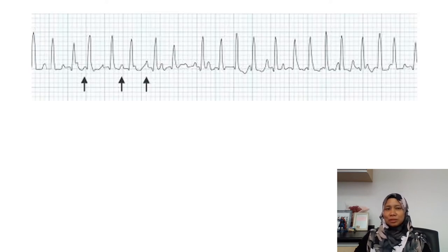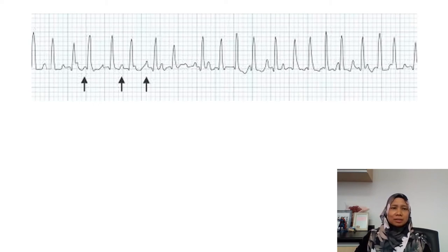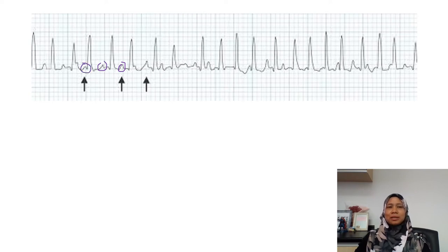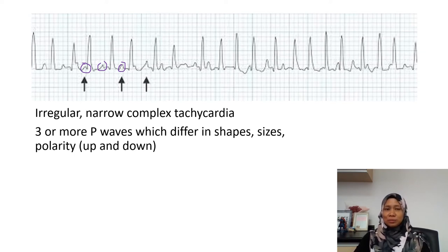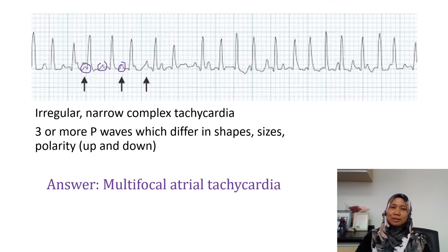The next strip is also an irregular rhythm with narrow complexes. However, we can see there are some P waves — here and here — with different shapes and sizes. This is an irregular narrow complex tachycardia with three or more P waves that are different in shape, size, and polarity. So this is multifocal atrial tachycardia.